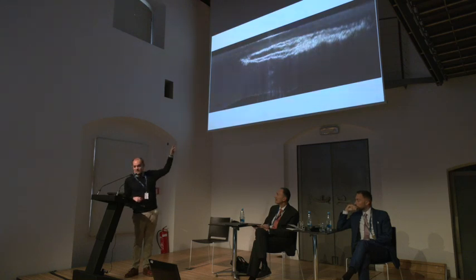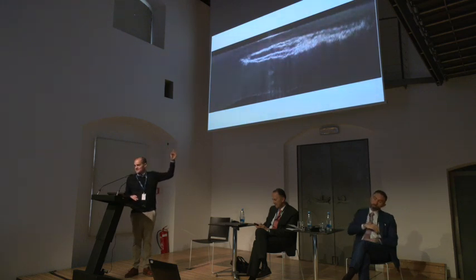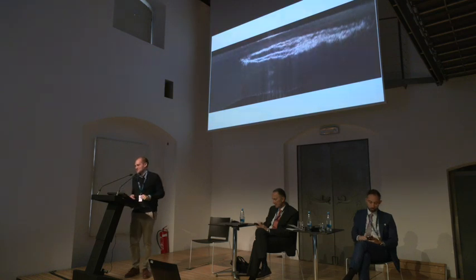Anyways, you can actually see the separation that the bubbles created on the lenticule, and you can see that it's a biconvex shape. So, you know, the ones who know. So what did we decide? What do you do with a patient like that?